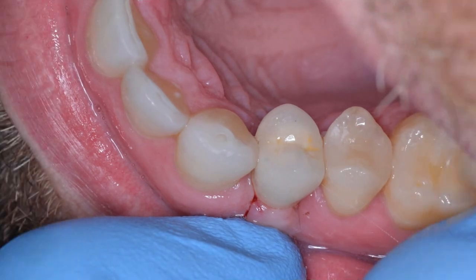So other uses of the H incision, you can see in this particular case, a patient where we placed some locators, we did a little bit of H incision here. Basically, you're trying to augment the soft tissue biotype around these, in this case, Zest Anchor locators for the retention of a complete lower denture. You can also help ensure that this tissue is going to be nice and thick in this area as well. Not just keratinized tissue, but nice thick tissue.